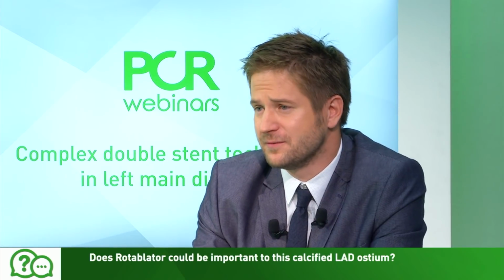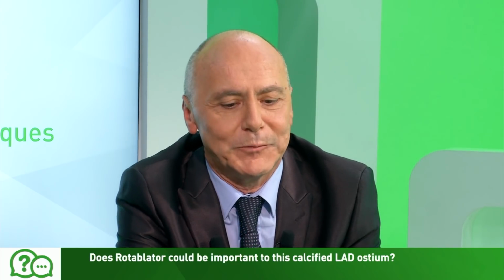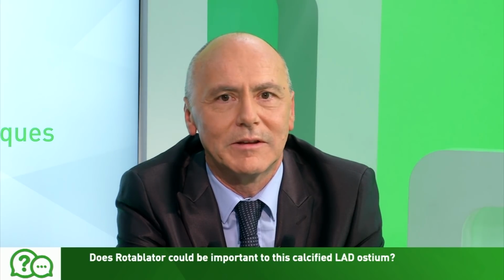Before we close this case, there are a couple of questions from the audience we can address. First of all, could a rotablator be important for this calcified left main LAD ostium? Well, you achieved a nice result now with balloon alone. For this particular case, after you see a nice expansion of the non-compliant balloon, I think this is proof that you will not need a rotablator.